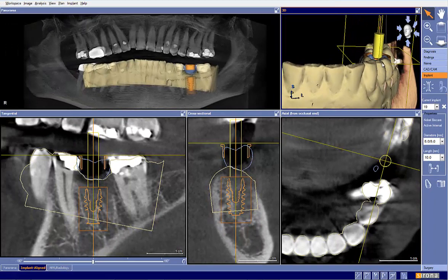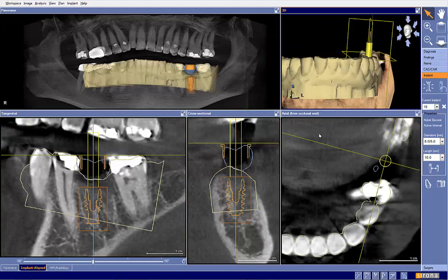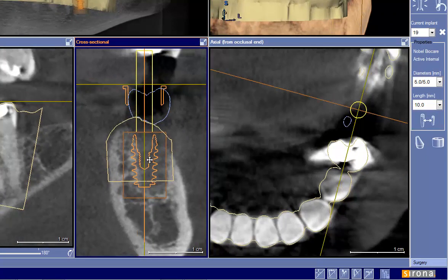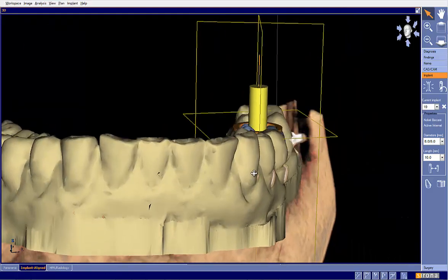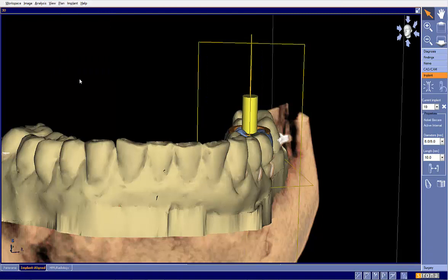What I do know is that lower molar teeth are typically tilted in. And in this plan, we can see that we're actually tilted straight up or even tilted slightly to the buccal. So what I would actually do in this case is probably tilt this implant back like this, and probably even move it back out just like that. And now we have a slightly better tilt there. Let me take a look at it with the original plan so you can see the difference between the two. So there we go with the original plan, and there we go with the adjusted plan, and that just seems to fit more in line, better along the forces that we'll see there.